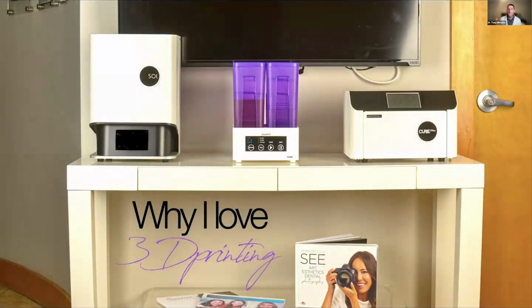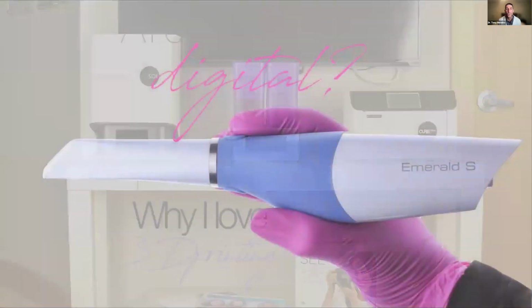And then on the right is a post print cure box, because a lot of the times the material properties of these materials can be increased by doing post-processing, post-curing of those materials. And so all three of these are really important steps in the process. So just so you understand, if you get into printing, it's not just buying a printer, you're basically getting this whole system and this whole workflow.